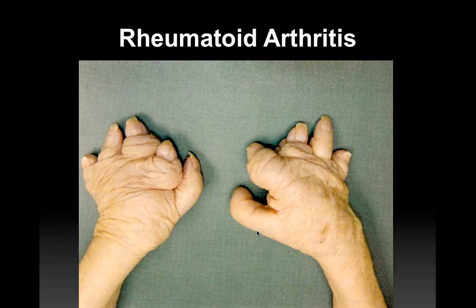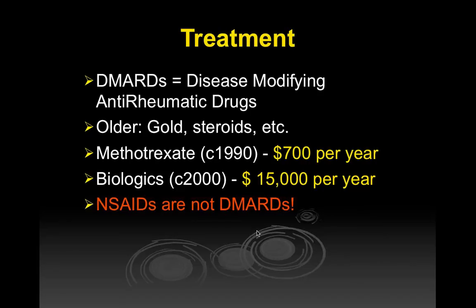In a classic study by a guy by the name of John Sharp, who developed a Sharp score for X-rays, to actually show that gold was marginally effective at that time, it became known as a Sharp score, and it was kind of the basis for the way rheumatology has really evaluated imaging studies ever since. He died last year, unfortunately. But we'll talk a little bit about that and some of the equivalent scores that are currently used in MR imaging for evaluating rheumatoid arthritis.